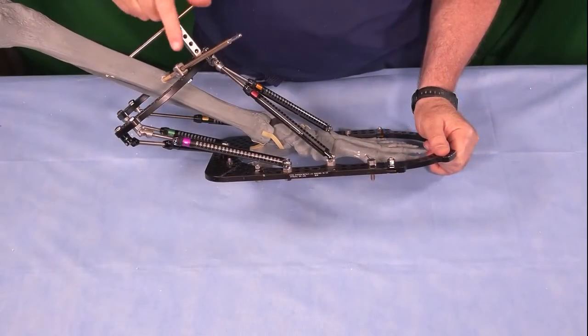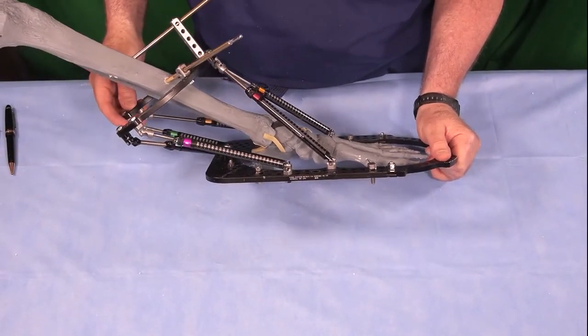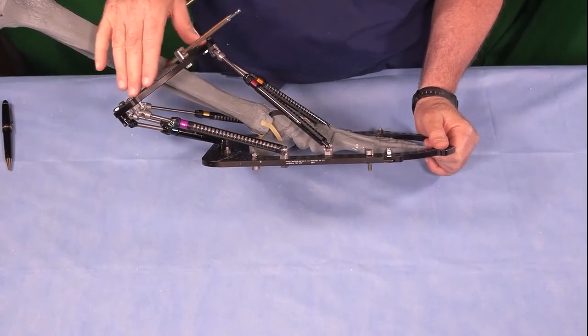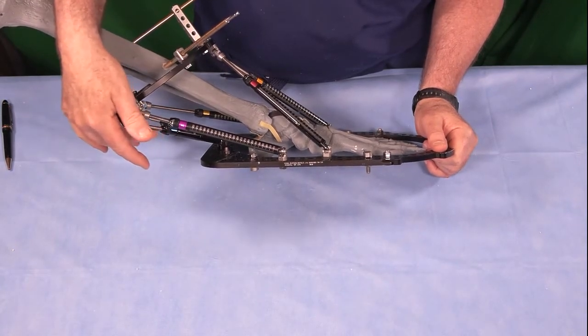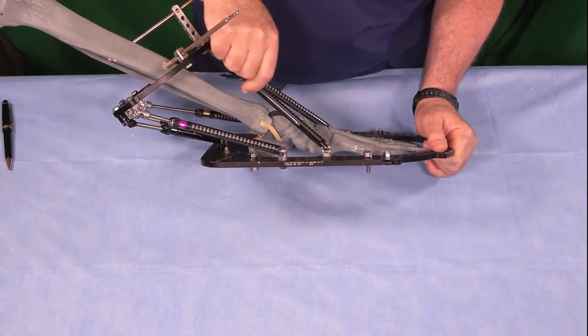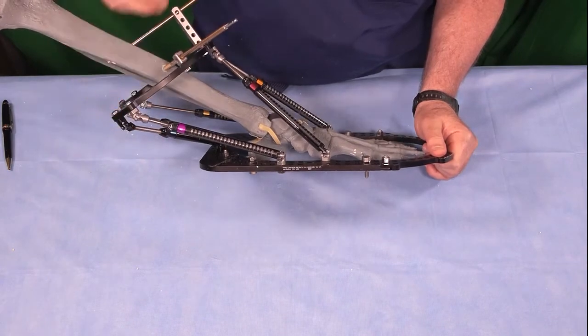At this point, I've completed the application of the 6 hexapod struts to this frame. You notice by having this ring canted downward in the front and upward in the back, it gives us more leverage in the back for pushing the foot into dorsiflexion. Here we'll be pulling up into dorsiflexion, but here we're pushing down into dorsiflexion.